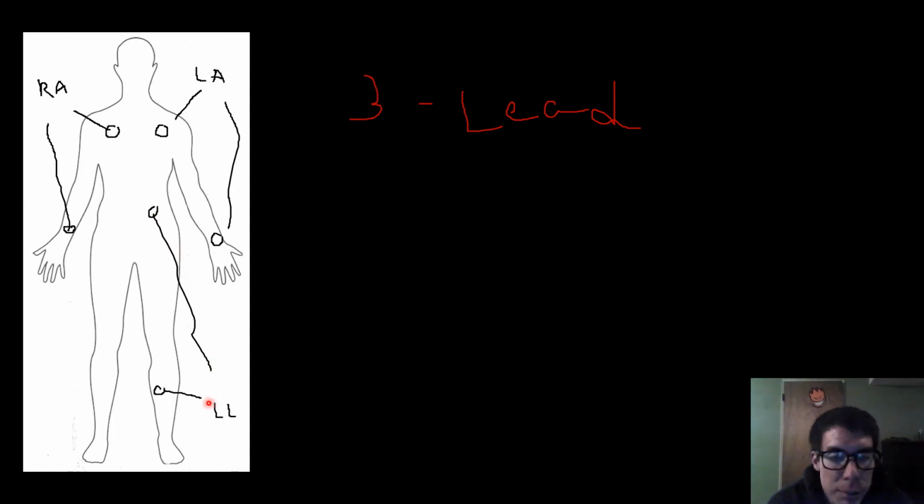And the important thing when you put it here or with any electrode really, is you don't want it to be over a bone. So like how the shin goes right there, you wouldn't want to put it there. It should be over a meaty area, because that will keep it from having trouble. If it's over a bone, it's hard for the sensor to detect anything, so it's best to put it kind of on the calf there.